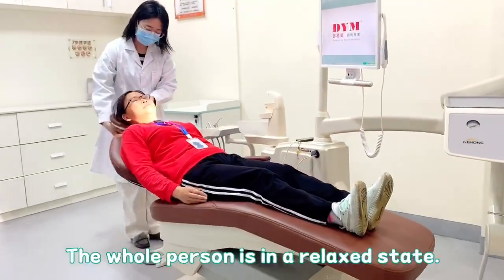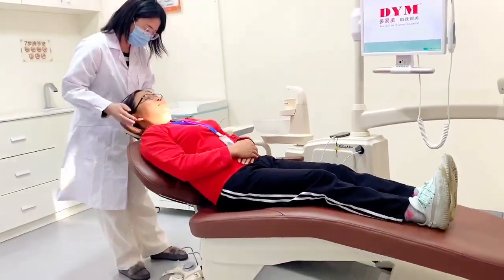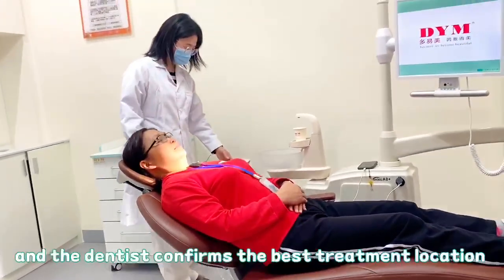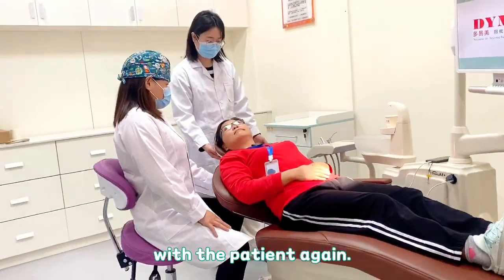The whole person should be in a relaxed state, with two hands crossed on your abdomen. The nurse adjusts the headrest and backrest to the best position, and the dentist confirms the best treatment location with the patient.